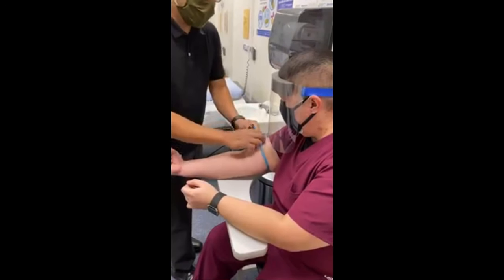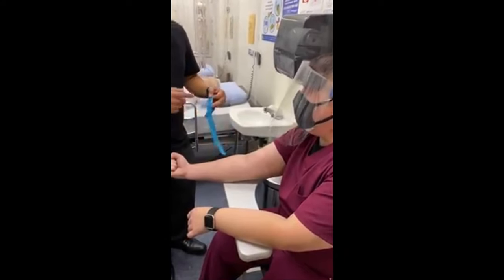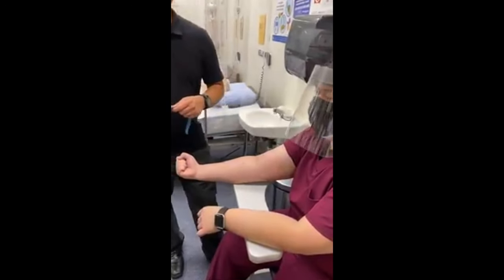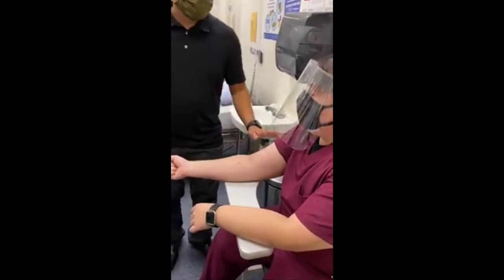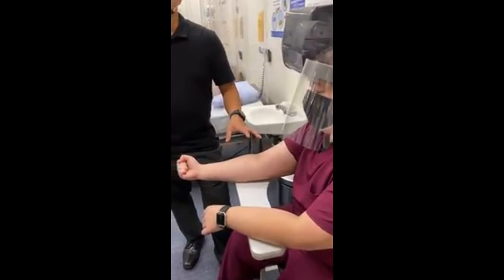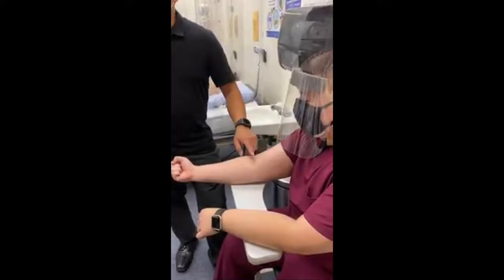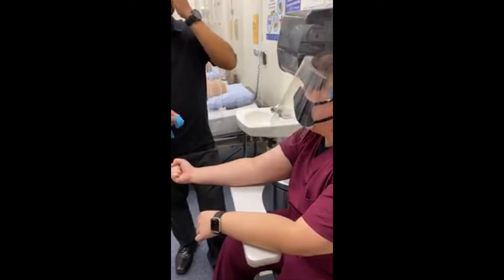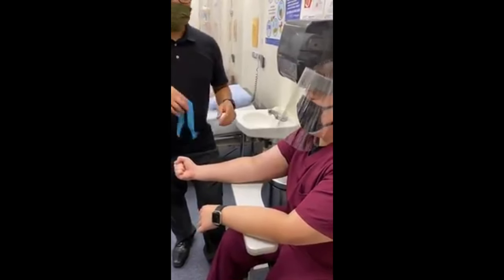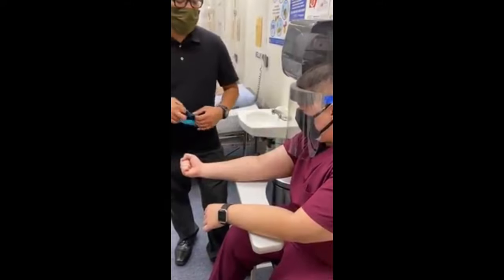Okay, so I'm gonna do it again, how to put it on. Then Ryan, after I do it a couple times, I want you to put it on me, okay? Okay. How come there's some people that do double tourniquet? Oh, the only time you do double tourniquet is if the vein is really deep, just to make that vein more prominent. For example, if I had an obese patient with really huge arms, and I noticed the vein is deep, I would double tourniquet. It increases my chances for the vein to come out.